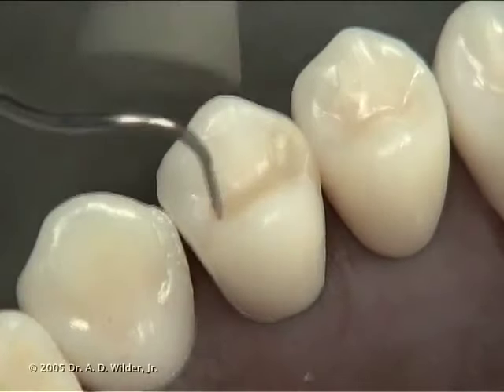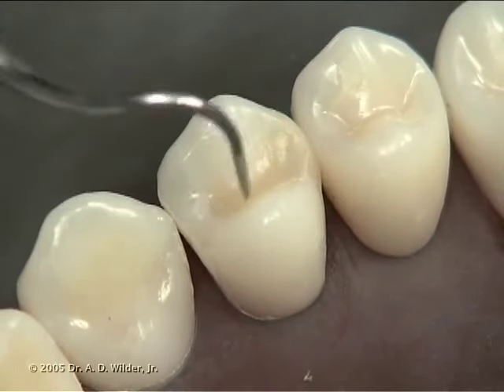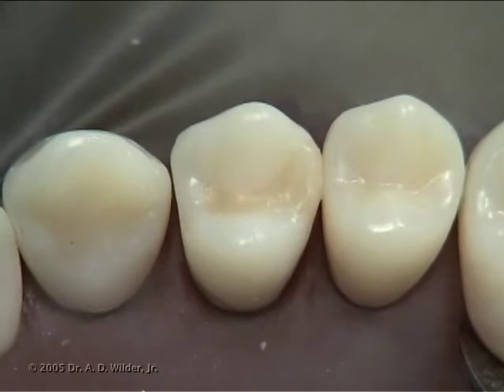You can check one last time for flash, then verify your proximal contact by running waxed floss through the contact, and check final occlusion with articulating paper.